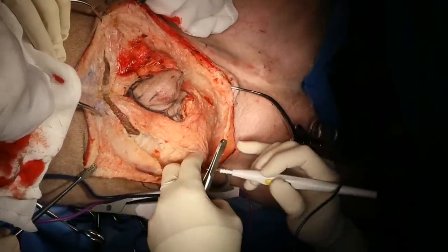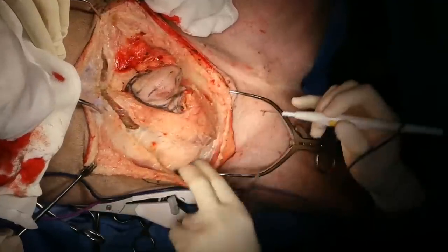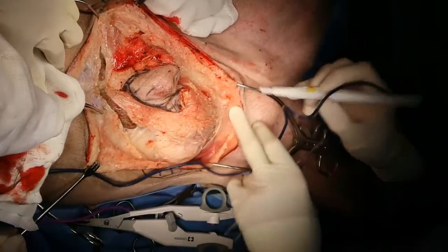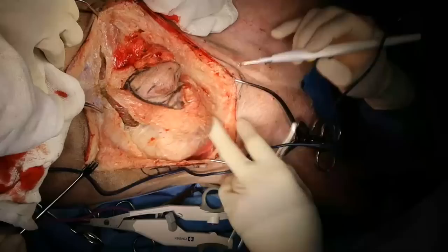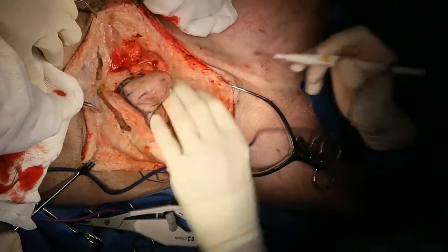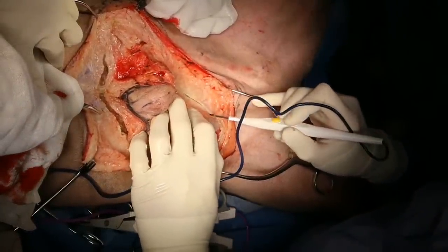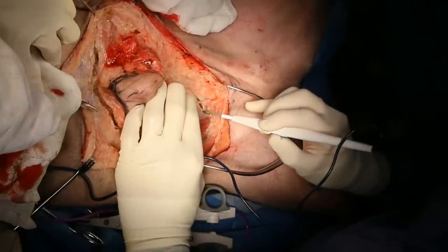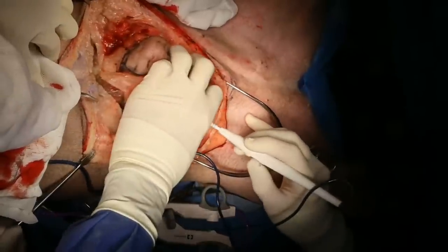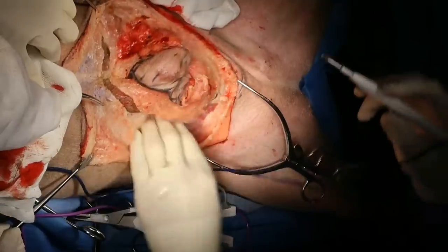So that's rectus muscle there that we're cutting through. And that's tumor there that I can see. Couple of centimeters of abdominal wall beyond what I can palpate. And that contraction that we're seeing is not that the dog can feel it.